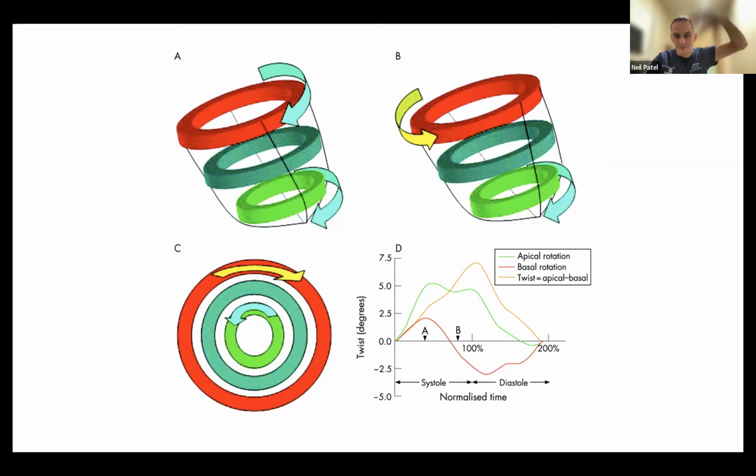So the magnitude of difference is actually the sum of the absolute numbers of the rotation at each level. Thanks, Mahmood, you give me the thumbs up, so hopefully everyone's still with me.